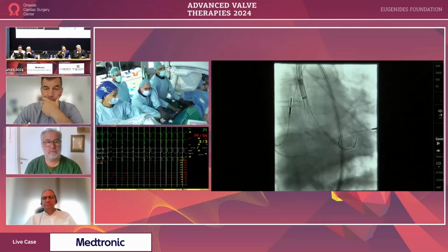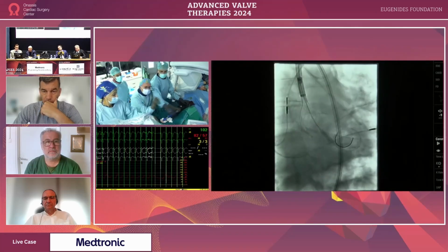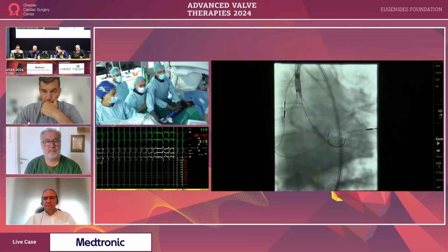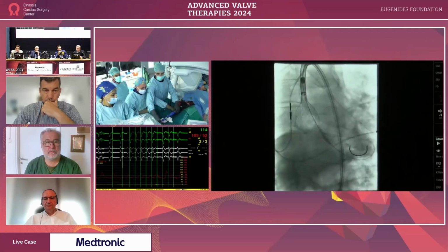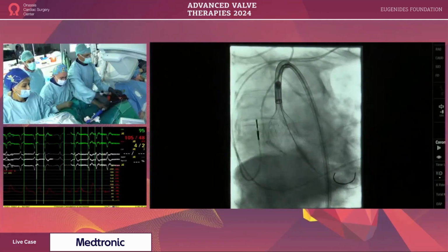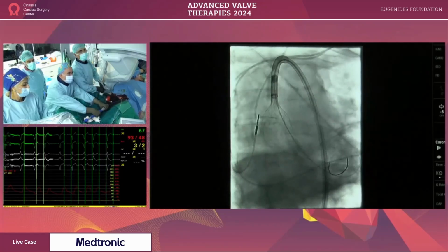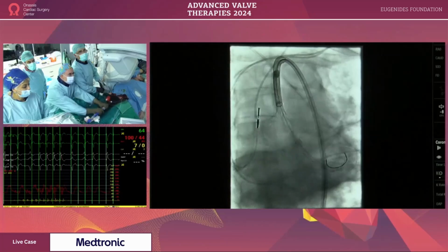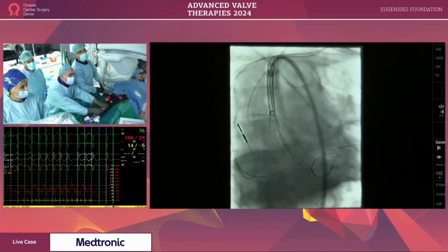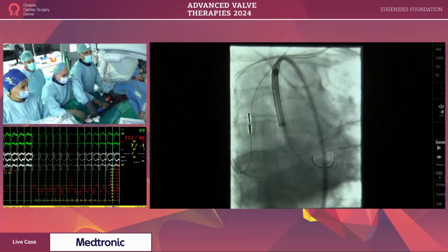Okay. You see, this is just so, one VPC. 120. Yeah. Okay, wait a little bit. Now it caught it. 120. So, let's recapture. The consensus here is you have to recapture and then go in and pace much faster in order to create more stability. Everything seems to be moving quite a bit, and magnify more.